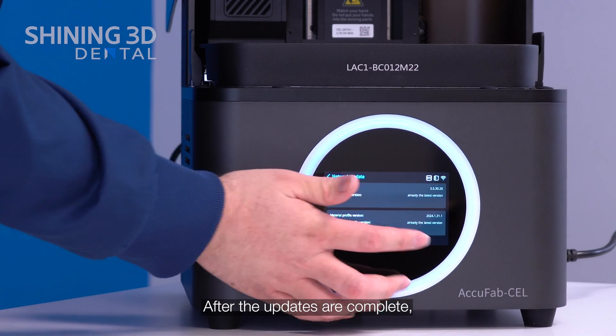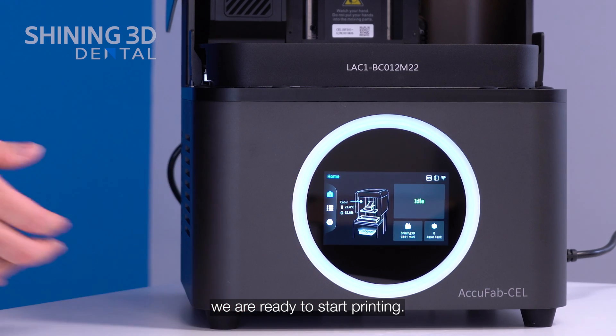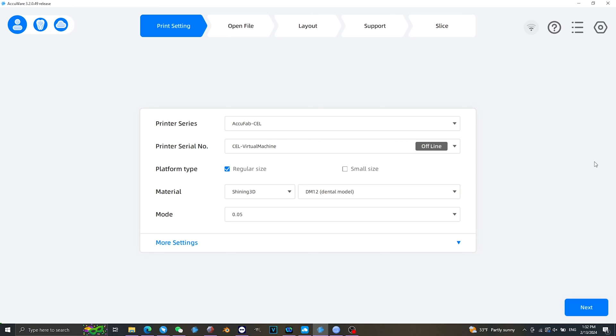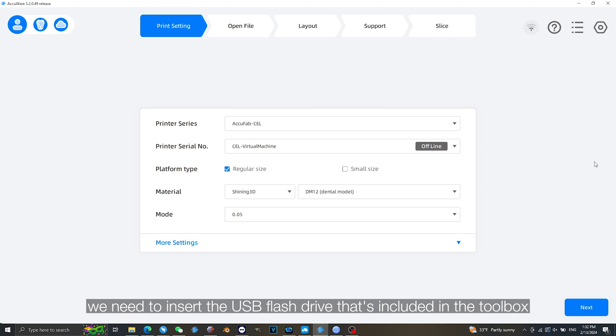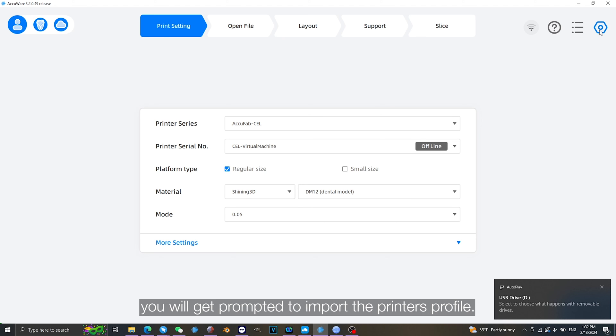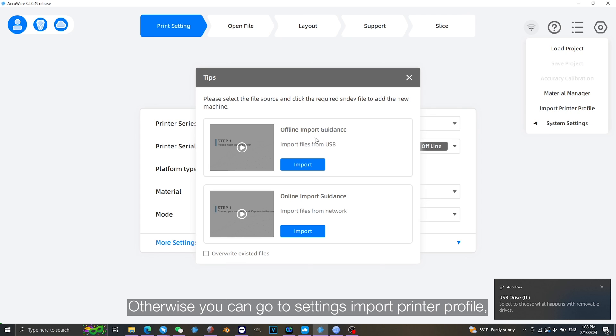After the updates are complete, we are ready to start printing. Next we will move over to Accuware to connect our printer to our computer. In order to bind our AccuFab cell to Accuware, we need to insert the USB flash drive included in the toolbox into our computer. If it is your first time starting Accuware, you will be prompted to import the printer's profile. Otherwise you can go to Settings and Import Printer Profile.